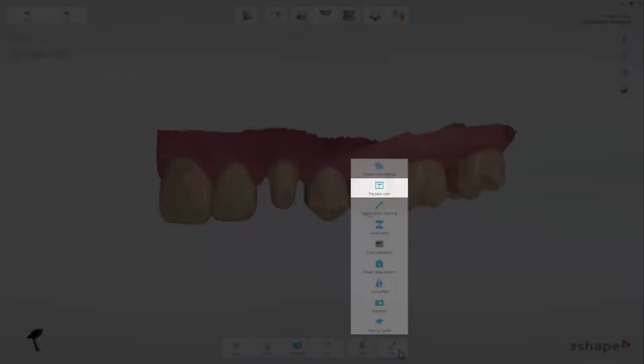Playback Scan shows how the scanner maneuvered around the patient's mouth. A very useful tool for educational use and for support purposes.